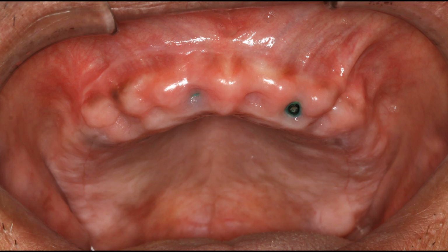This is the appearance of his upper jaw 2 months after the initial surgery. And what I like here very much is that we were able to maintain some of what we call gingival architecture. It's the peaks and the valleys around where the teeth used to be. And that's important in making a final prosthesis that looks, feels, functions, and cleans just like bridges on teeth.